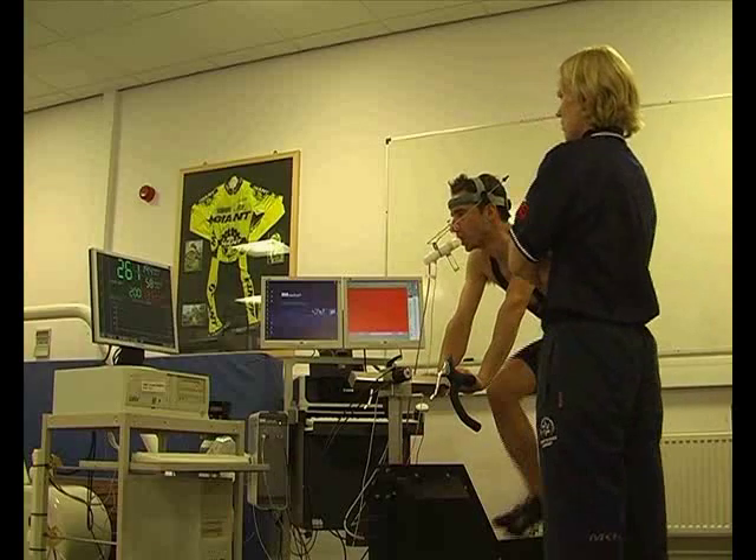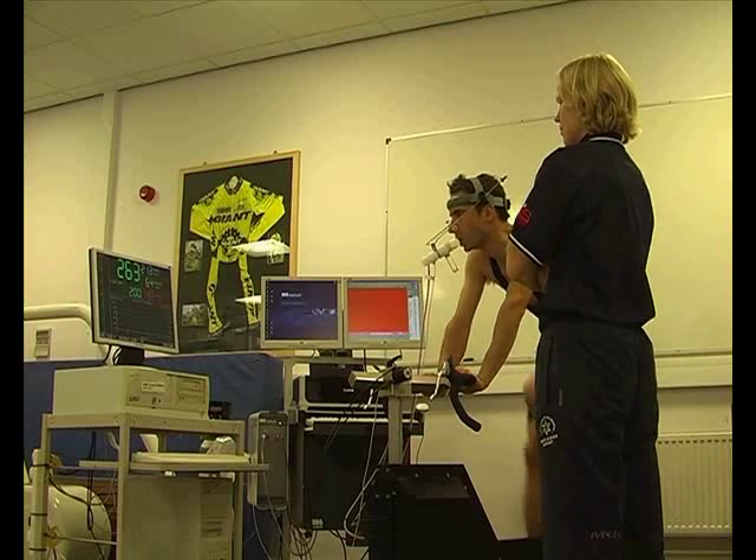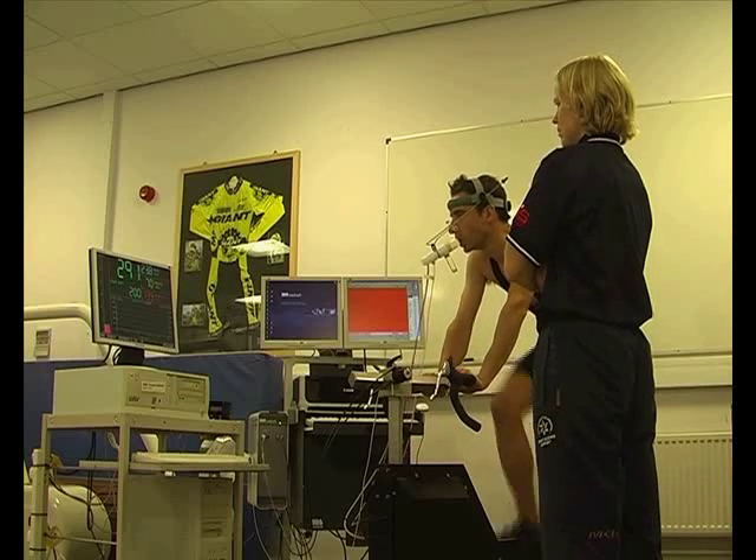Because the athlete has to overcome the inertia of the flywheel at the beginning of the test, it takes a little bit of time for the power to get to the target power. You can see it's above 200 at the moment, but it will soon settle.